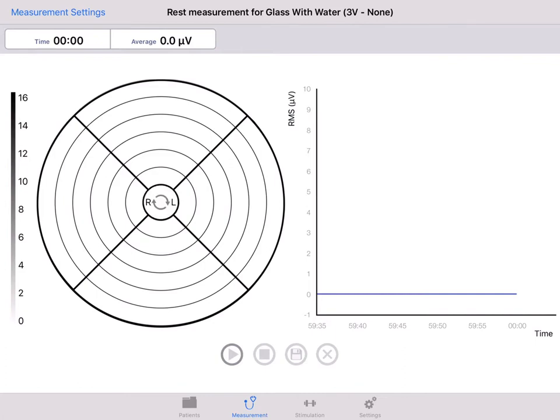On the right a line graph is displayed. This line graph shows you the average EMG of selected electrodes in microvolts. Above the grid and line graph you see the time and also the average EMG of the selected electrodes in microvolts.